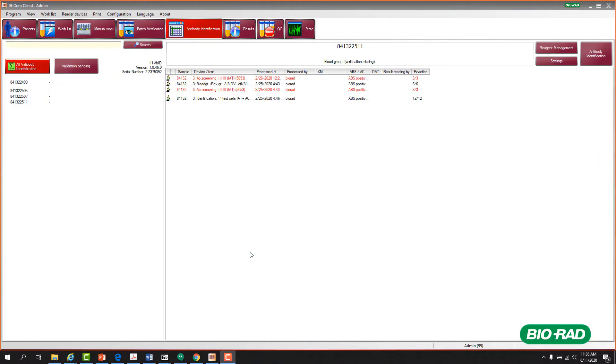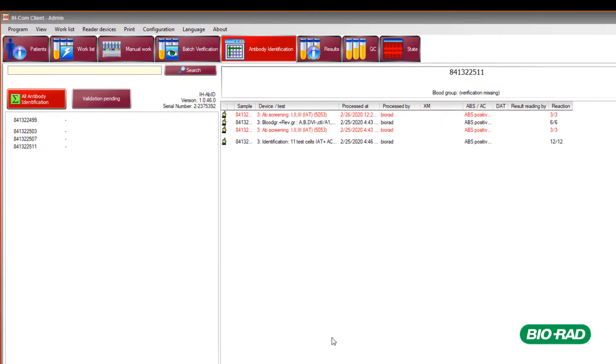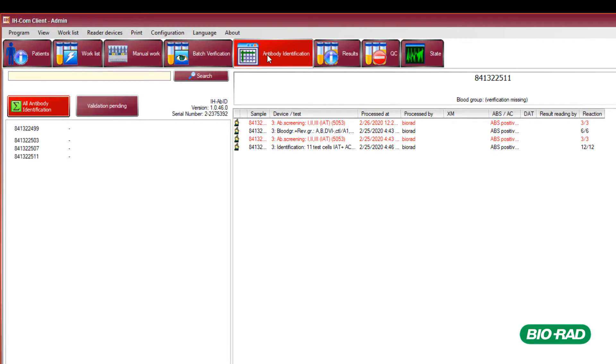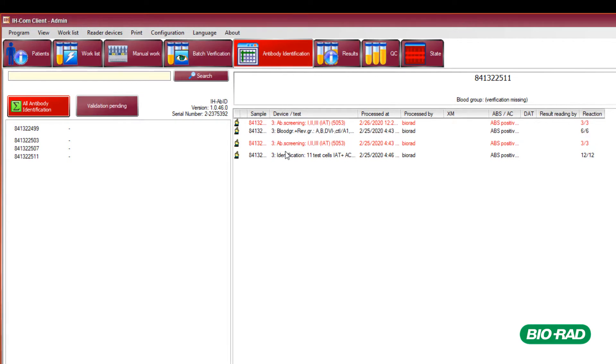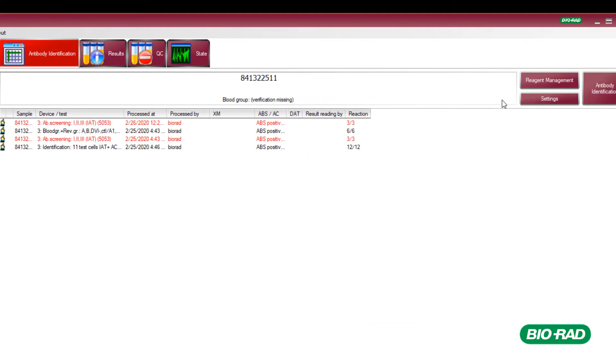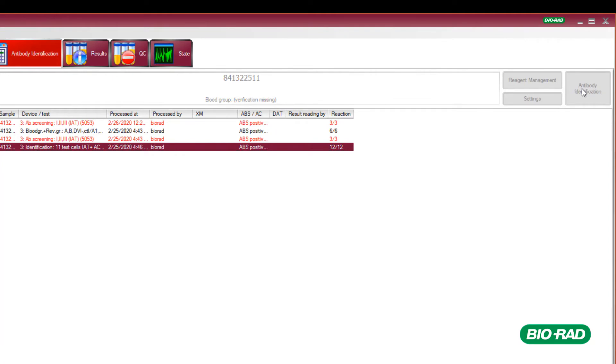Once Antibody Identification testing is complete, the results will be available under the Antibody Identification tab. The corresponding result is selected and Antibody Identification is selected.